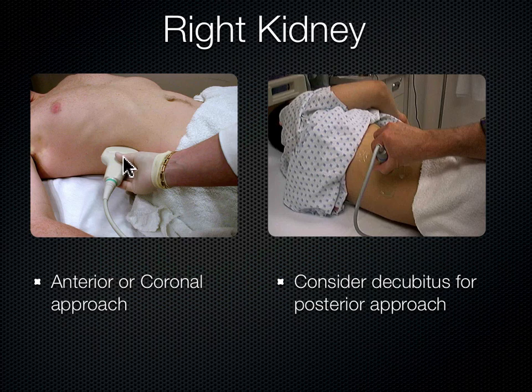Occasionally, though, you've got to take the probe and drag it up anteriorly, up here. But whenever you drag the probe anteriorly, keep in mind the kidneys are still kind of a posterior structure, so to compensate for dragging the probe anteriorly, you're going to want to also fan the probe posteriorly. Okay, so I'll say that again.